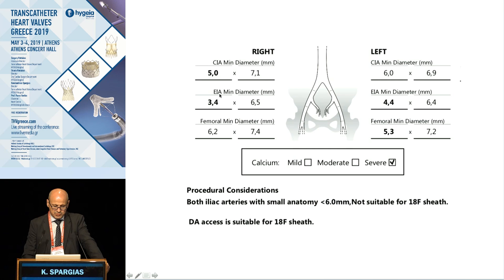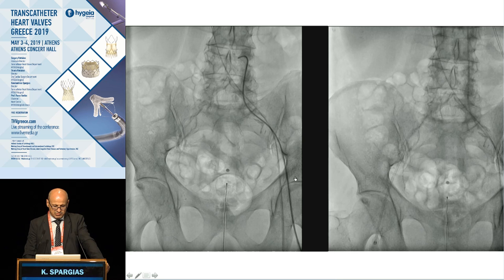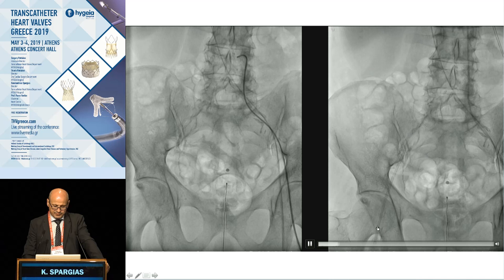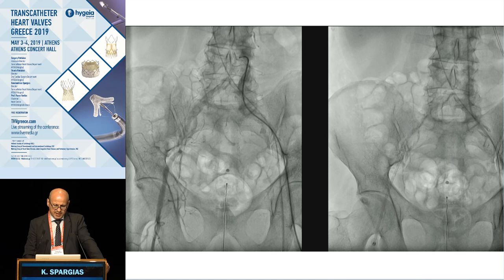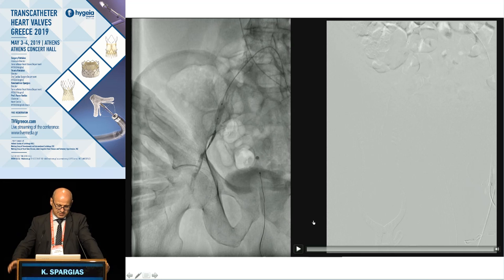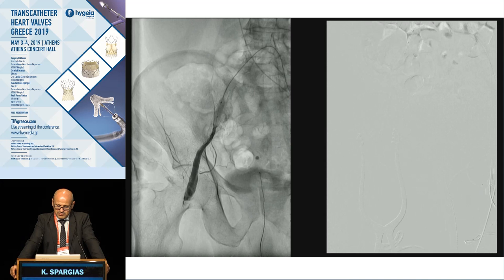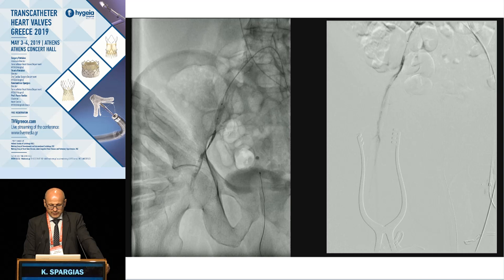Here is another patient with very small right and left femoral arteries that do not fulfill the criteria for transfemoral access. After careful evaluation of CT imaging, we decided to give it a try. We proceeded with ProGlide and an E-sheath and implanted a 23mm Sapien 3 valve with a very good result. However, at the end we had an obstruction and dissection. We had no other option but to ask our surgical colleagues to come in and help, successfully completing a surgical revision in this case.